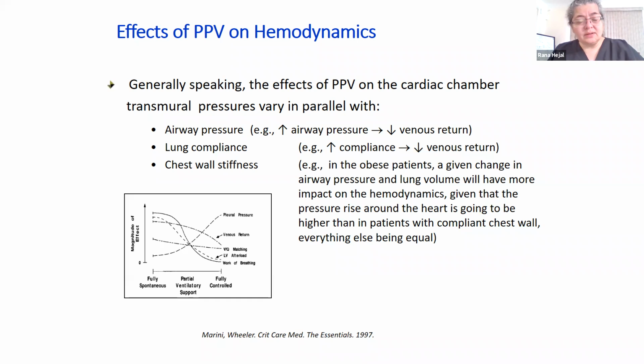And we will proceed with not only a relatively low tidal volume, which needs to vary depending on what the plateau pressure is doing. So you really want the plateau pressure to be below 30 at all times. So you keep on decreasing the tidal volume for that. But also by optimizing PEEP, because as you increase the PEEP, the difference between the plateau and PEEP gets smaller because you're recruiting lung.